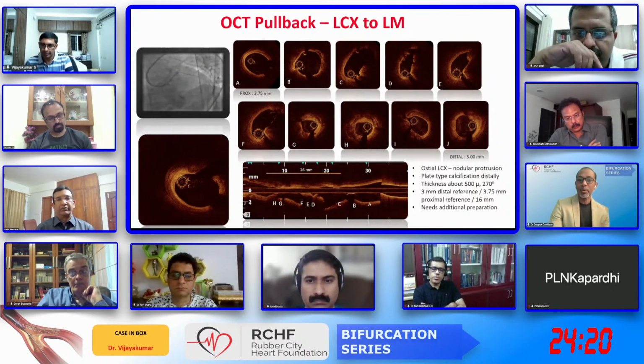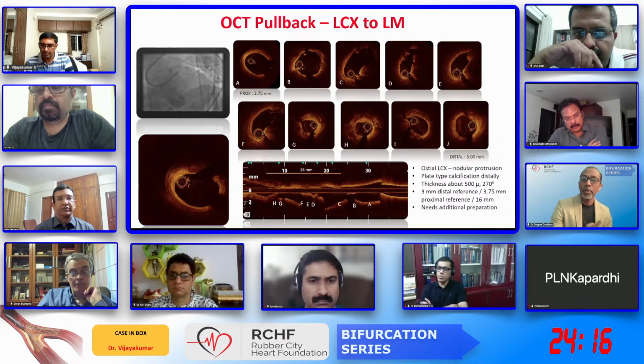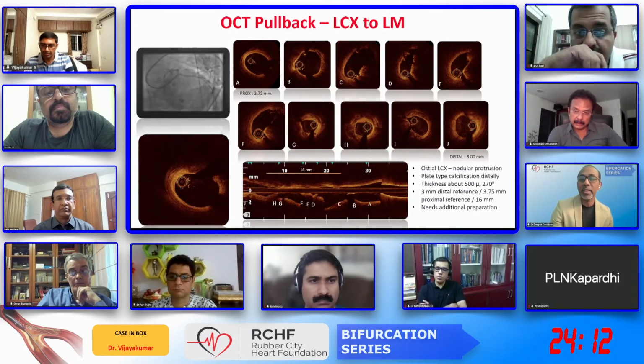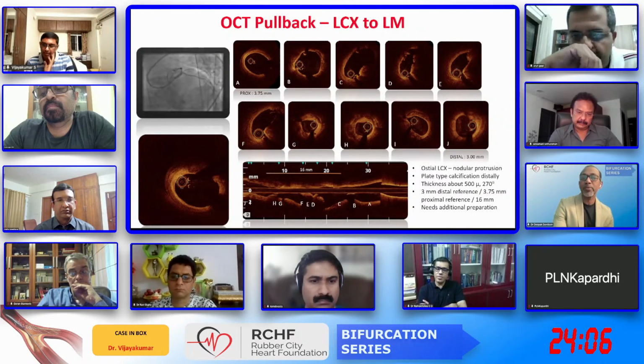Secondly, if somebody is so bothered about doing further lesion preparation, Dr. Selmani, what is your opinion on this? Would you go ahead with a 1.5 millimeter rotor burr, hoping that you might shave off a little bit of the calcified nodule?